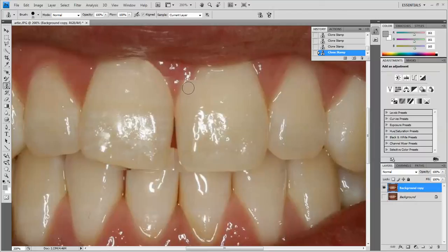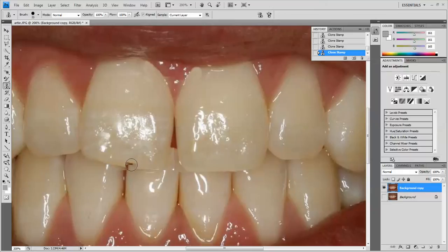I'm going to come over here, click on this, and select a different area, because now we're on a different tooth and it could have some subtle differences. So we've mostly done that. Now we need to worry about this diastema here.